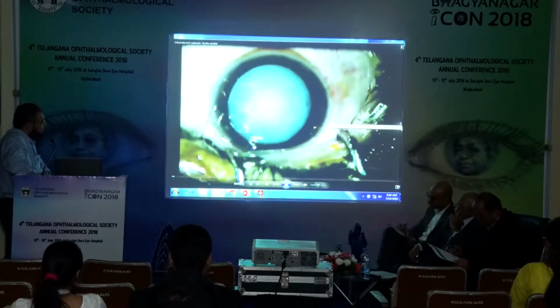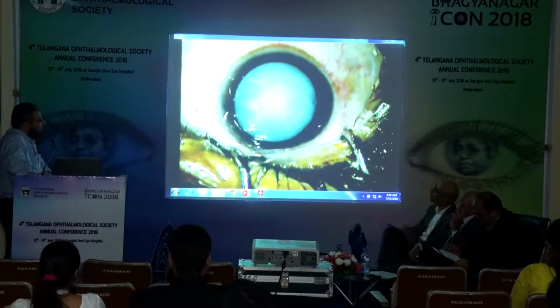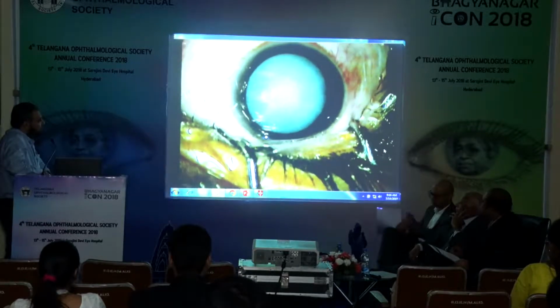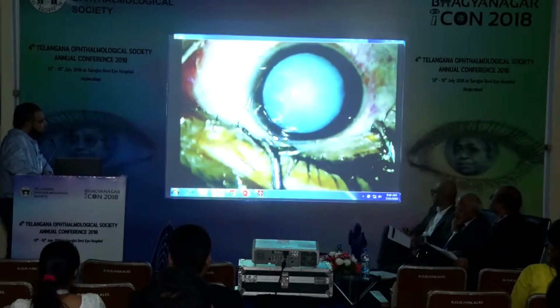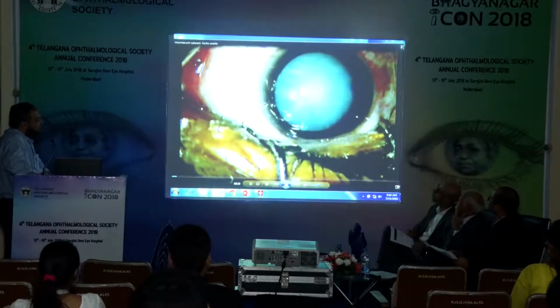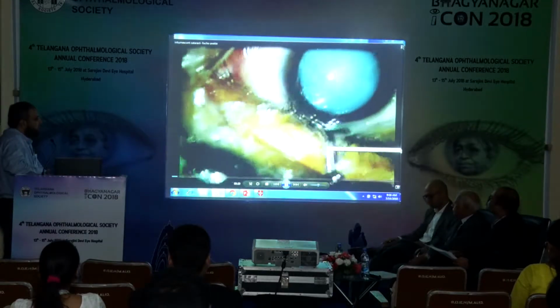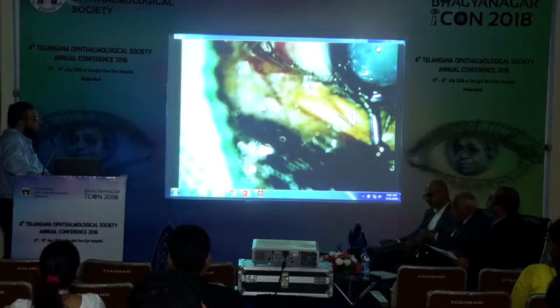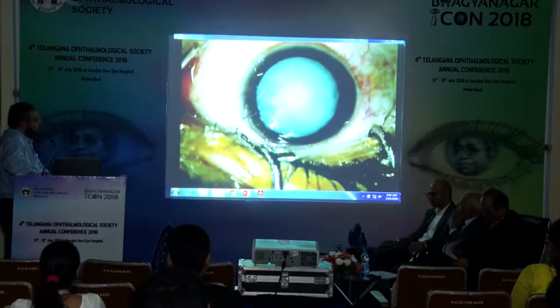This is a slightly longer video. It's basically a cataract in a patient with Fuchs uveitis, a 19-year-old boy, and he presented with an intumescent cataract. So the important thing I want to highlight here is that surgery in Fuchs iridocyclitis is very different from other uveitis, and it is relatively simpler.